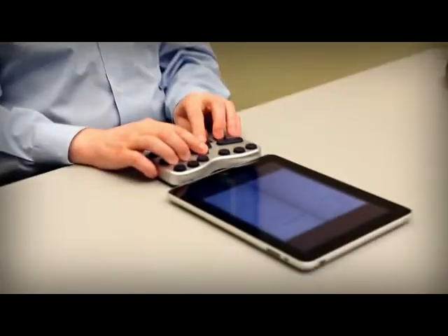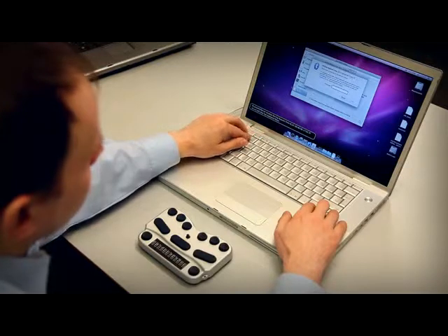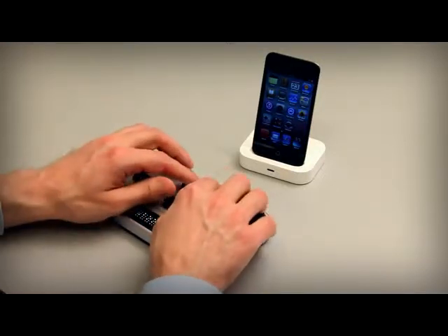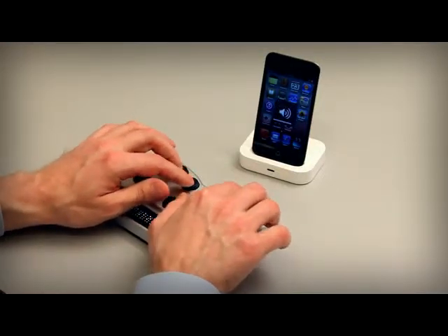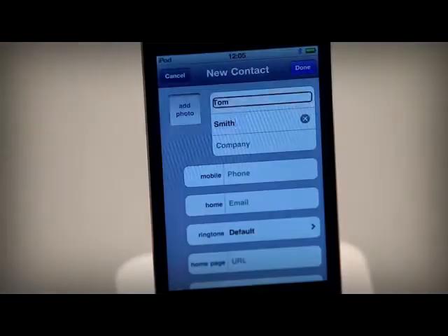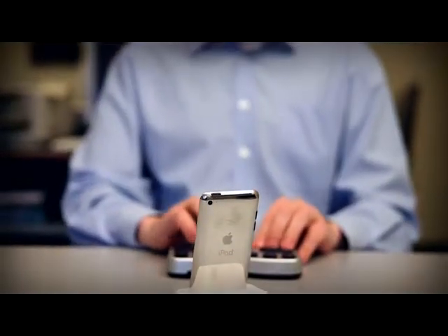Braille Pen 12 provides Braille access to many things, including the iPad, the iPhone, your laptop, and many more. Braille Pen gives you Braille access to the functions and features on the devices you connect to, whatever they are — from full-featured word processing through simple calendars, tiny apps to full web access, and in whatever language your devices and apps are using.